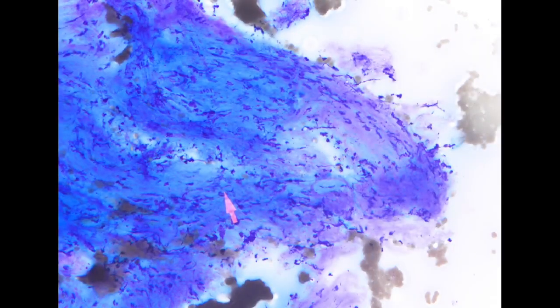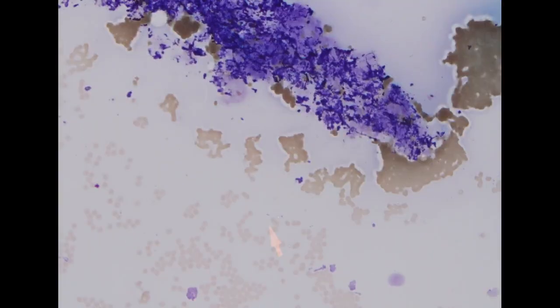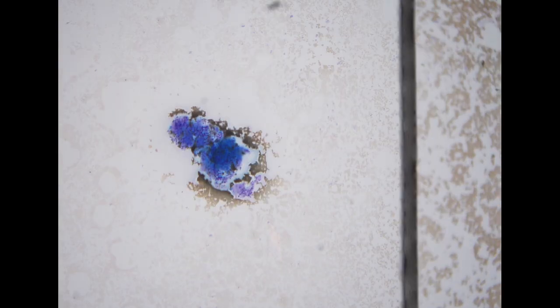And if we check the loose end, you can see the extracellular material, which more commonly has this magenta color. So the specimen seems to be from a soft tissue tumor with mostly spindle cells, and it is compatible with a schwannoma.